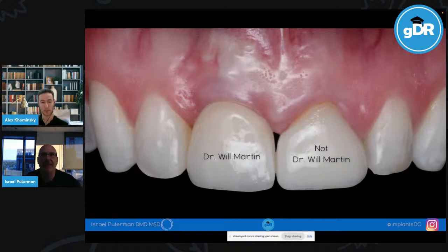Our tendency, if space is tight, is to have the implants too close together, and it's a challenge to separate them enough.